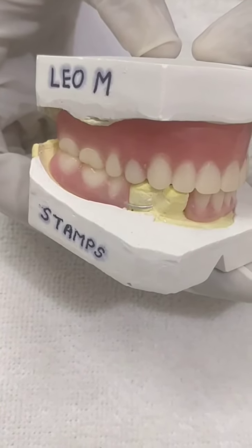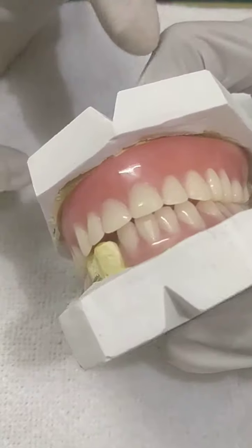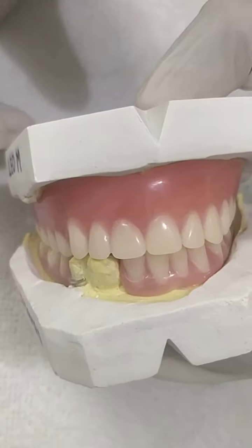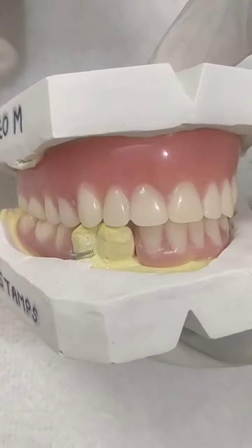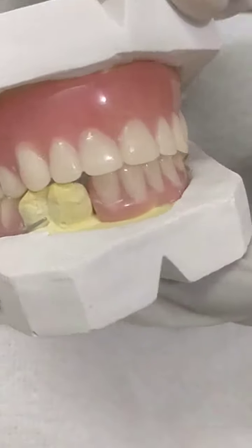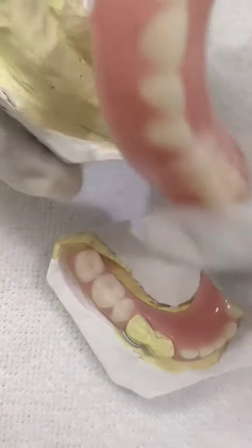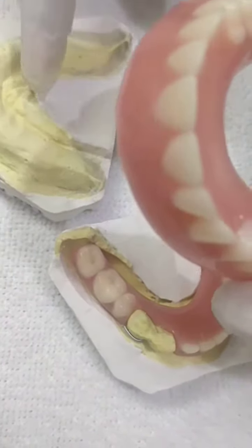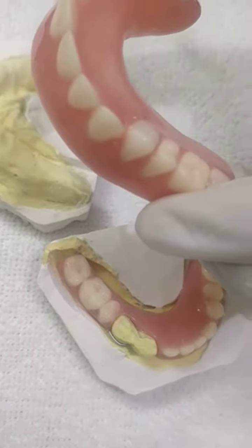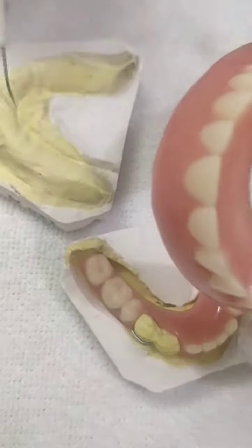Today I have made a denture for my patient Leo M Stamps. In a previous video I showed the wax try-in denture for them, and today I have acrylized it. The previous dentures they were having did not create a good impression of the palatal area, so I have kept it accordingly.